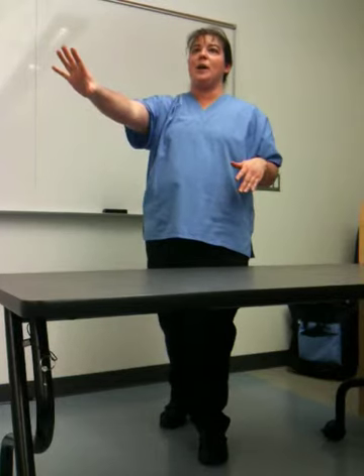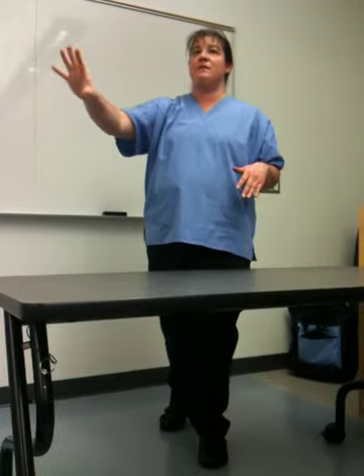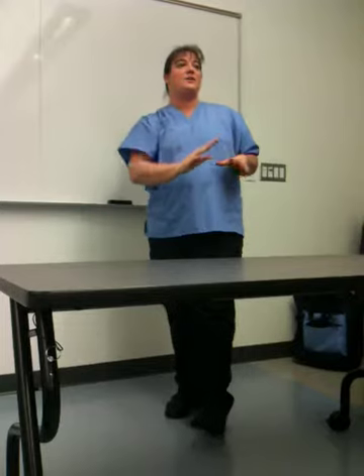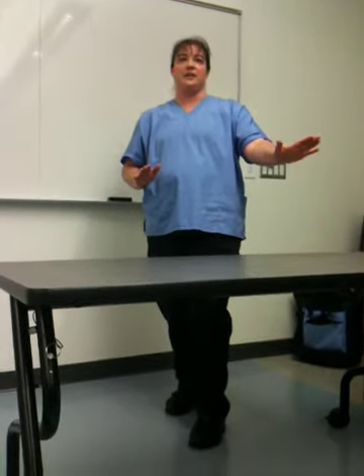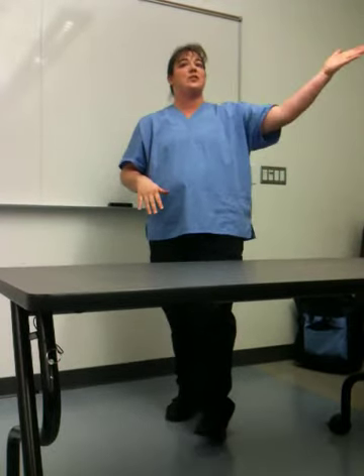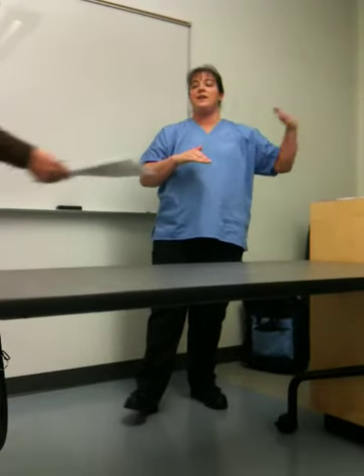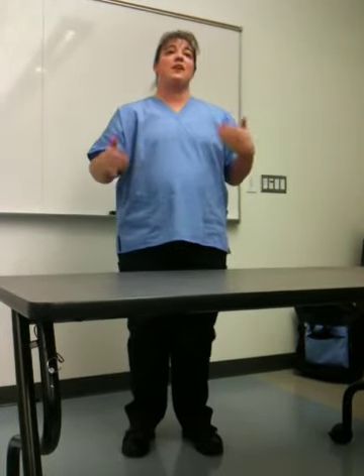I want to upgrade my airway with an OPA, NPA, bag mask, positive pressure ventilation, 15 liters per minute. I want to make sure those breaths are creating equal bilateral chest rise with no rise and fall over the epigastrium, and I can also auscultate lung sounds to verify that. I want to make sure another EMT gathers information about the event from the bystander, the lay rescuers providing CPR, any family, friends, or witnesses of the event. I then want to ensure that CPR is continuous without any prolonged interruption, and I want to verify its effectiveness.